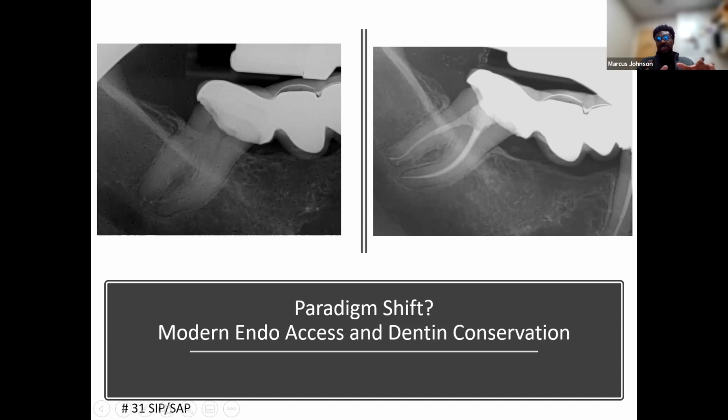Very challenging because the mesial inclination of the bridge was concerning. But you see, I was able to still maintain a lot of that dentin, keep a lot of that intact, manage that shape, manage that S curve, and restore the tooth as necessary. So now all she has to do is go back to get a check, make sure she can keep the gingival area clean, and she's good to go.